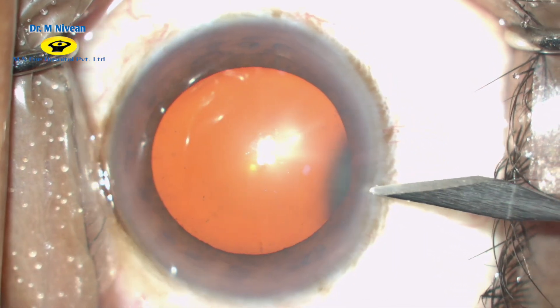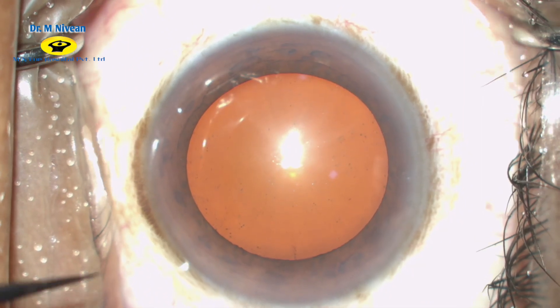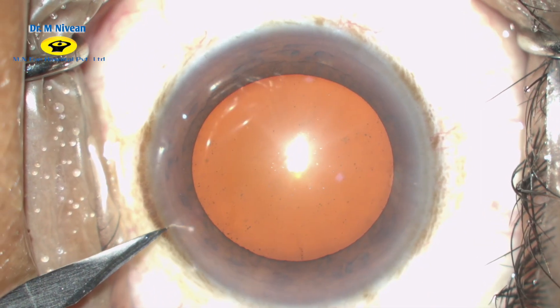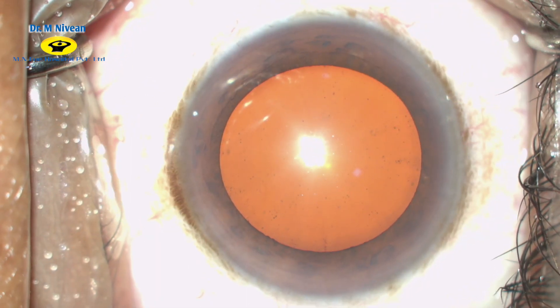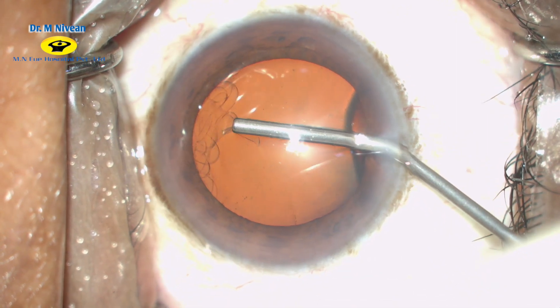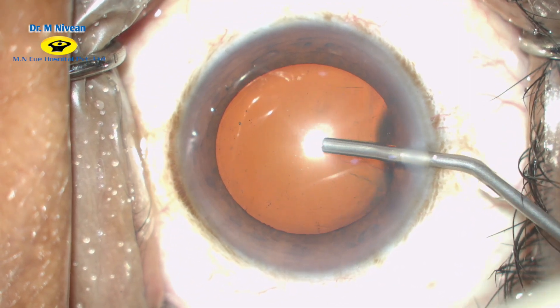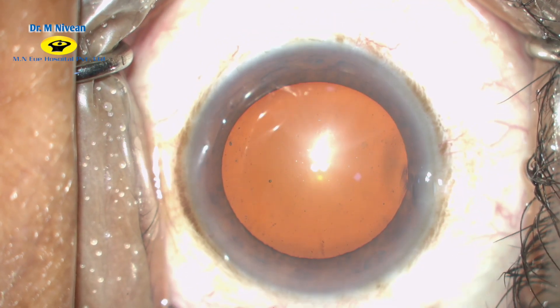This is the case of a routine grade 2 nucleus sclerosis planned for clear corneal phacoemulsification. Side port entries are made and viscoelastic is injected to form the anterior chamber. A good tight fill of the anterior chamber with viscoelastic is necessary for a smooth capsulorhexis.